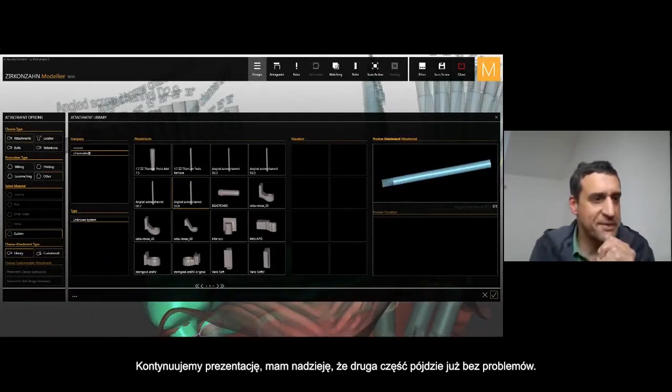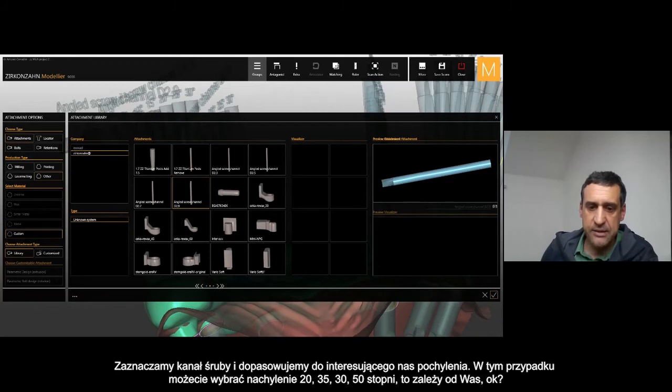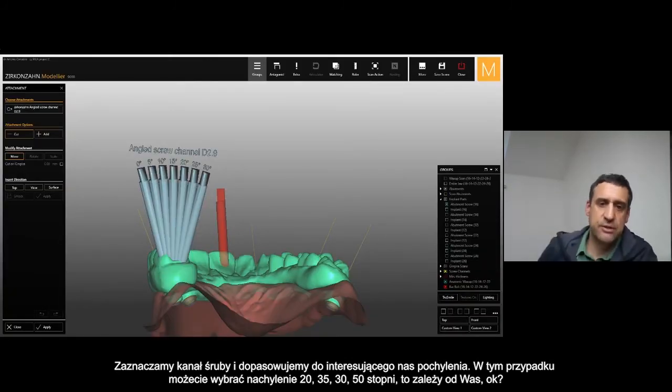Okay guys, so we continue. I will continue with the presentation and hope this second part will be easier and the presentation won't stop every moment. Once you finish the framework and it's merged, you go into freeform, and then in the library in Zirkonzahn you can find the channel screw with a different size. Select the right size — in our case it is 2.9. I select the channel screw and then I will merge and match this channel screw to the different inclination I want to use.